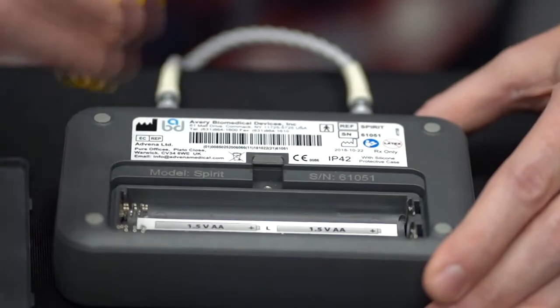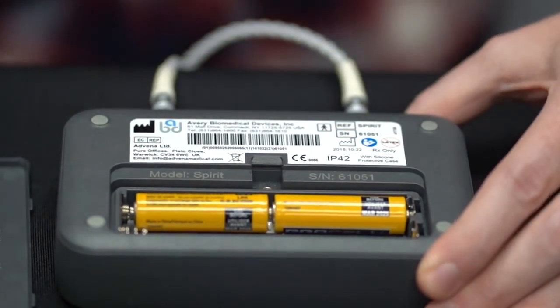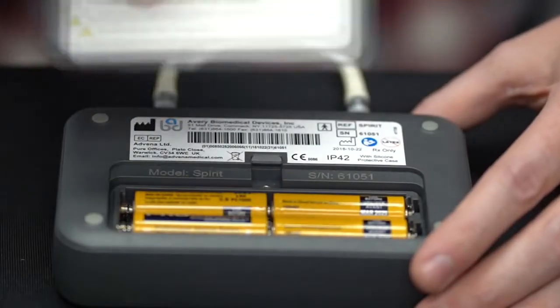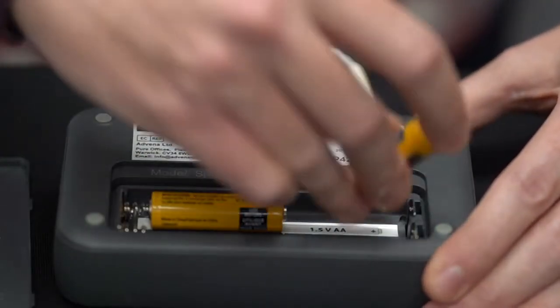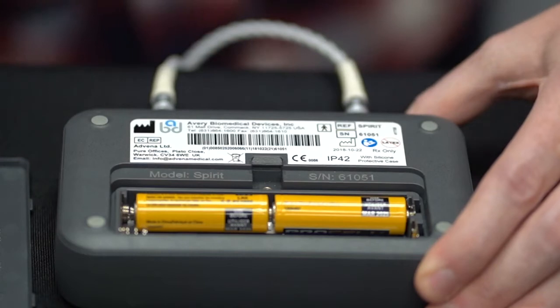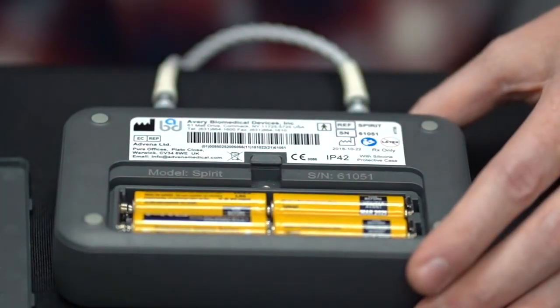Insert two alkaline batteries on the top row of the battery compartment — these batteries control the left side of the transmitter. Repeat for the bottom row; these control the right side. Replace the battery compartment door, bottom first, and snap it back into place. Follow these same steps when batteries need to be replaced, ensuring the Spirit transmitter is turned off. The system constantly monitors the battery voltage, and the icons on the display give a precise level of the battery charge of each side.